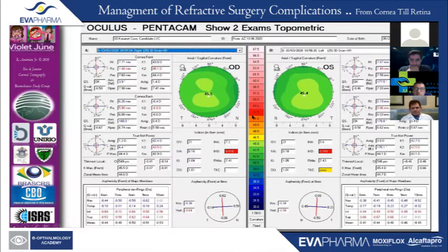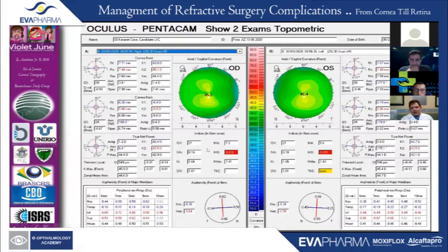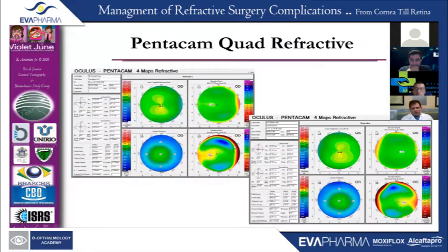And this is changed if you go to the scale with a 0.5 and now with a 0.25, a very sensitive scale. You see this skewness here, which correlates with high IHD. And this is important, that we go with an objective evaluation with the tomography data to see abnormality. But here in the quad map, it's not so obvious, but if you go for this, abnormalities here are identified.